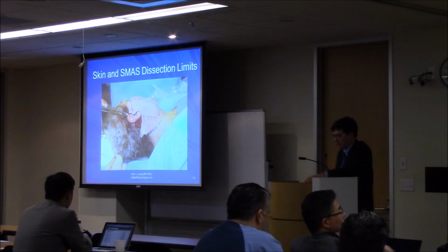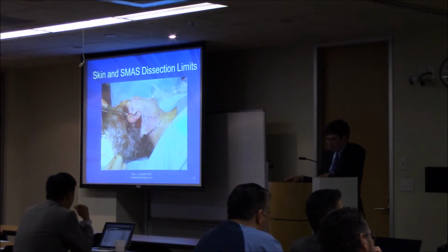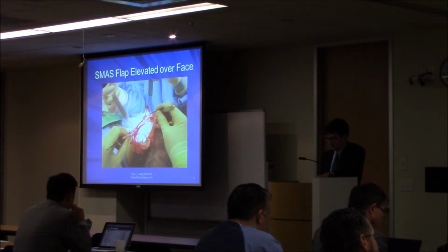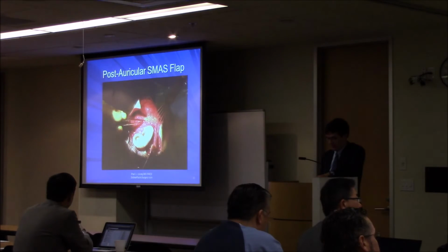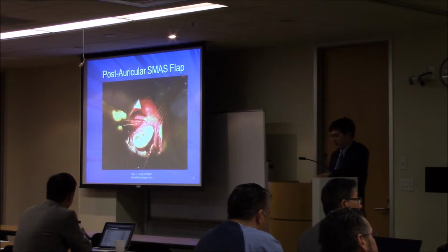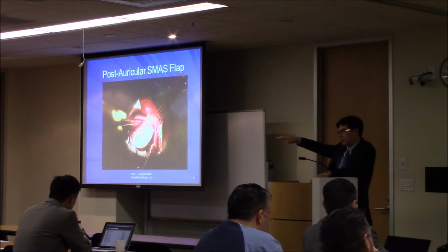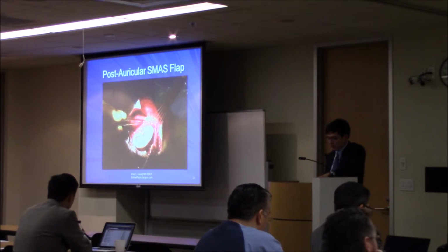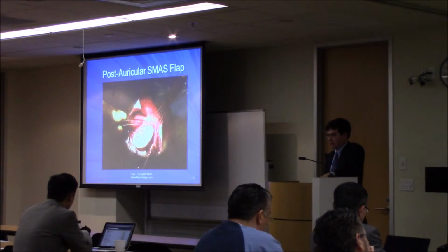This picture is meant to demonstrate where I'm elevating. The little dots versus the crosses show where I'm going to elevate the SMAS flap in the deep plane up to the high SMAS incision, whereas the dots are where I elevate the skin. That's me holding up the SMAS flap, and there is me laying it back down. Before I suspend, I cut this postauricular little tongue off and bring it behind the ear, because when I bring the flap superiorly and posteriorly there's obviously a little bit of excess, so I use it for that purpose.